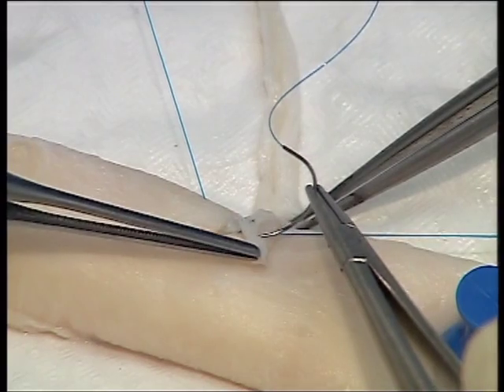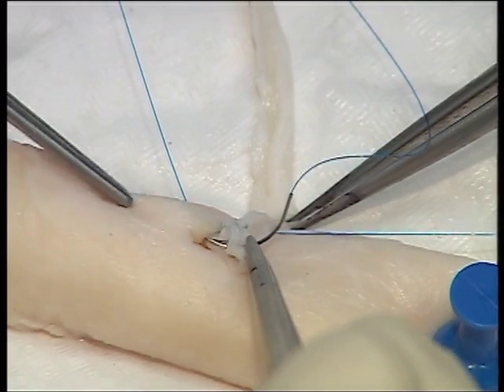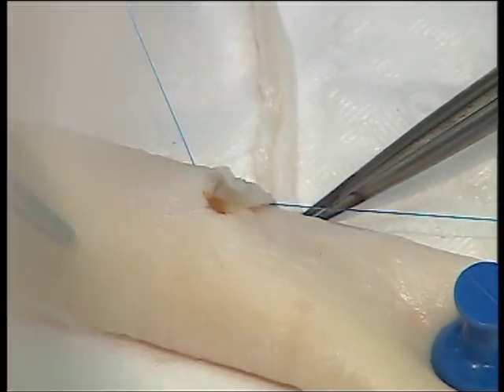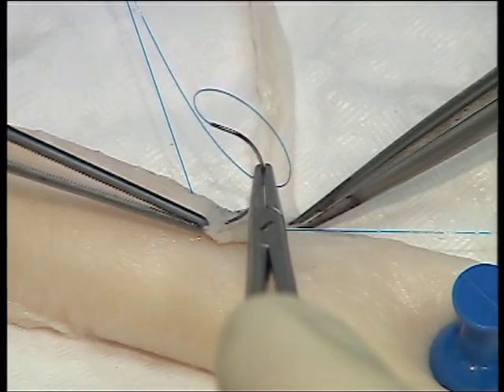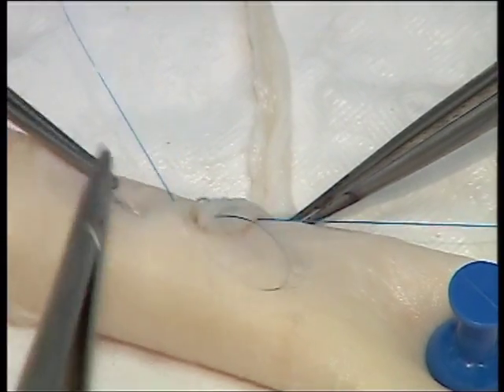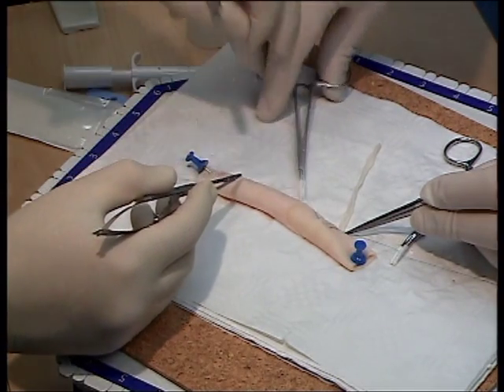Continue along this segment of the anastomosis until you reach the 9 o'clock position on the clock face. You should be halfway down one side of the conduit. Stop at this point and shod the suture.